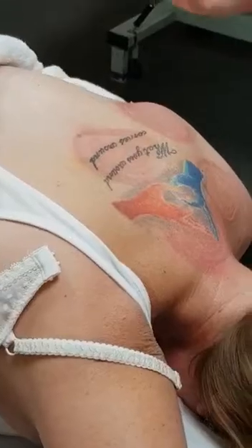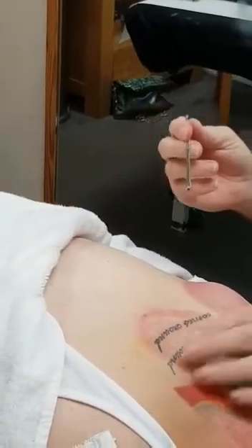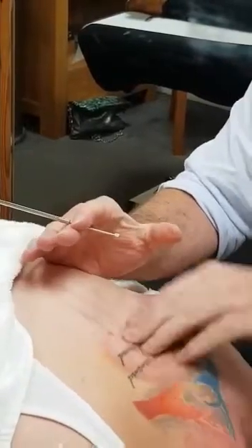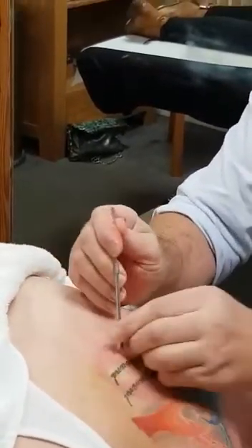So that's known as a plunger. This is the gun IMS technique on the upper thoracic. What we're looking for is shortened muscle tissues and connective tissues.